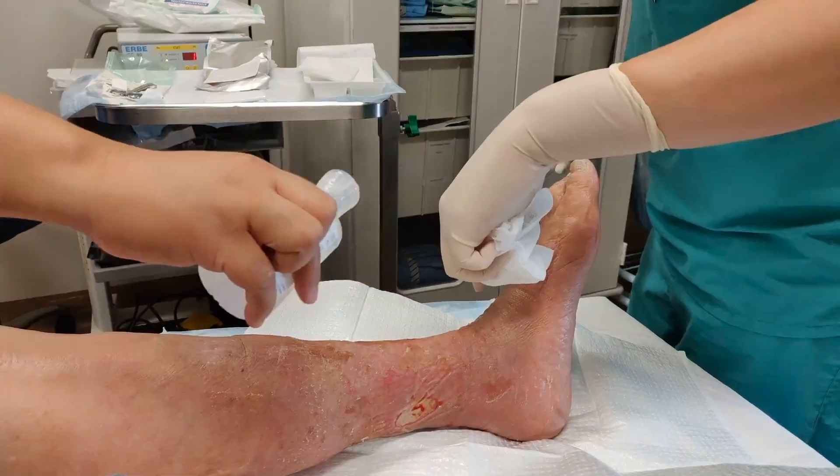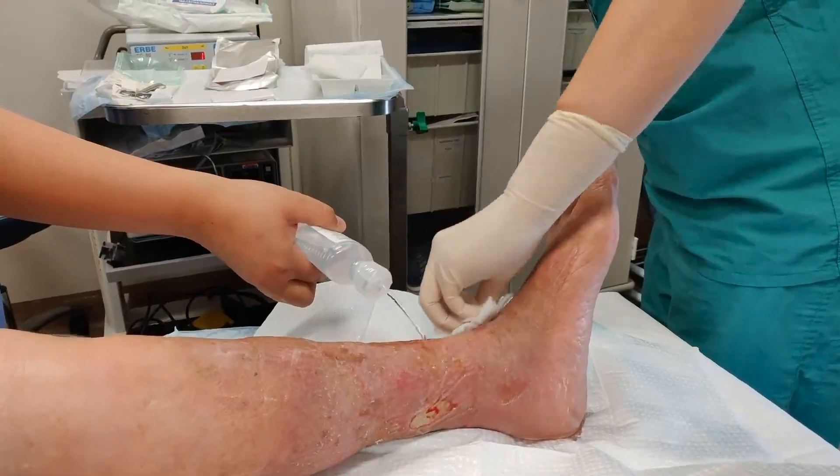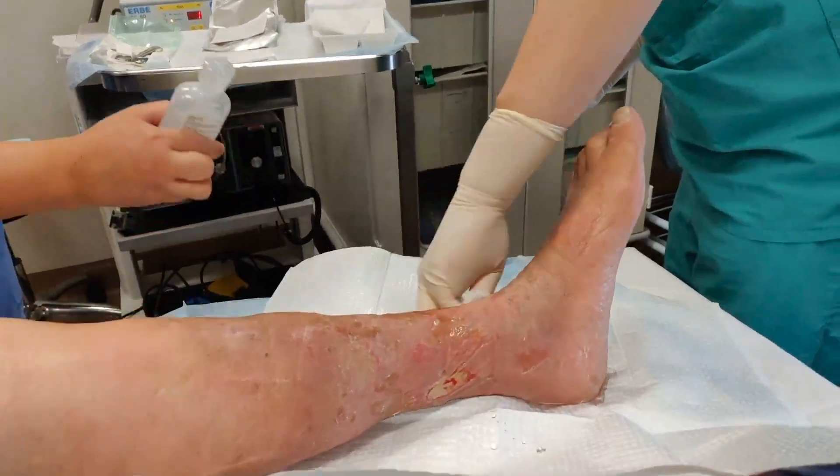This patient had a venous stasis ulcer on their lower left leg. The affected area must be cleaned and redressed. Here is the proper procedure.